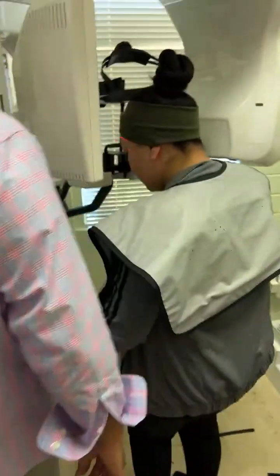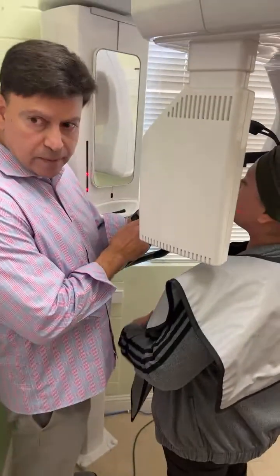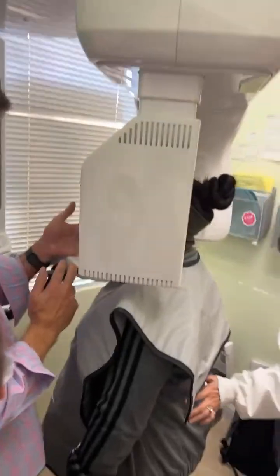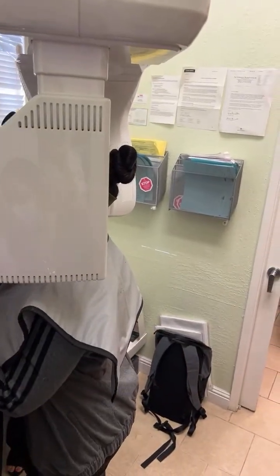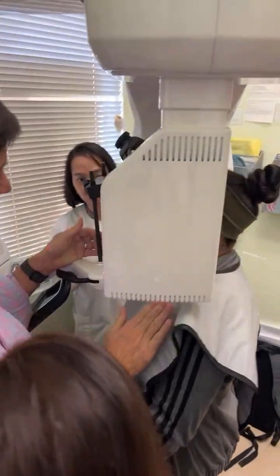Okay, what next? Adjust the position first. So the first thing you're gonna do is move this forward, remember? Like that. No, not forward, move it backward. You don't want it obstructed. Okay, wait, hold on, back up. Yes, thank you.